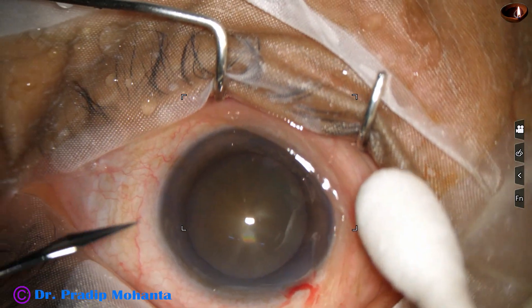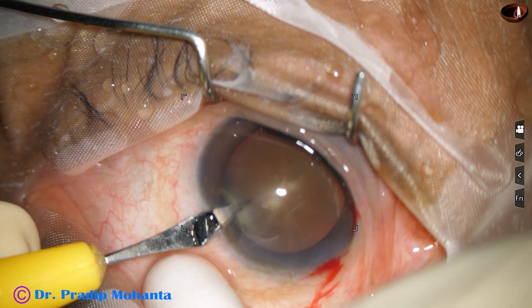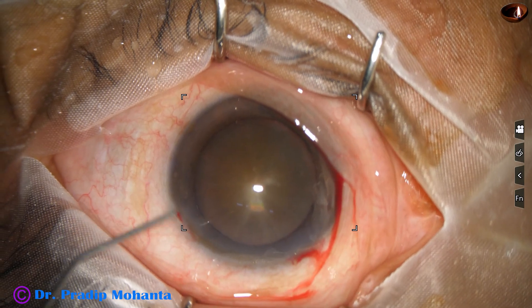A side port is made on the left side of the main incision, three clock hours away from the main incision. And now is the time to stain the anterior capsule with Trypan blue dye.